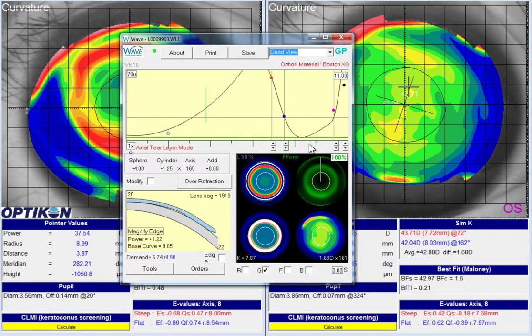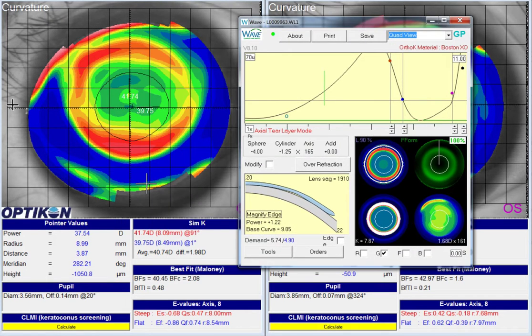to 950. So this will give us an overall more shallow lens and should give us a little bit better central compression. So the only caveat is this lens does look like it rides a little bit high, and usually when we flatten the lens, that will cause it to ride even higher. So we'll have to keep an eye on the centration.